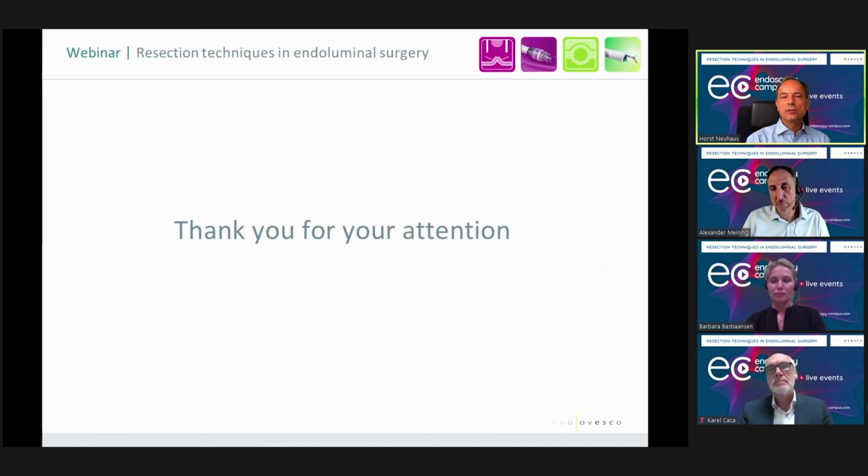So most of our patients with early cancers have larger lesions. For example, lateral spreading tumor 1S plus 2A. So you have a nodule within an area of a lateral spreading non-granular tumor, for example. We know the risk of cancer is 14% or so. And how to apply FTR in such a case?